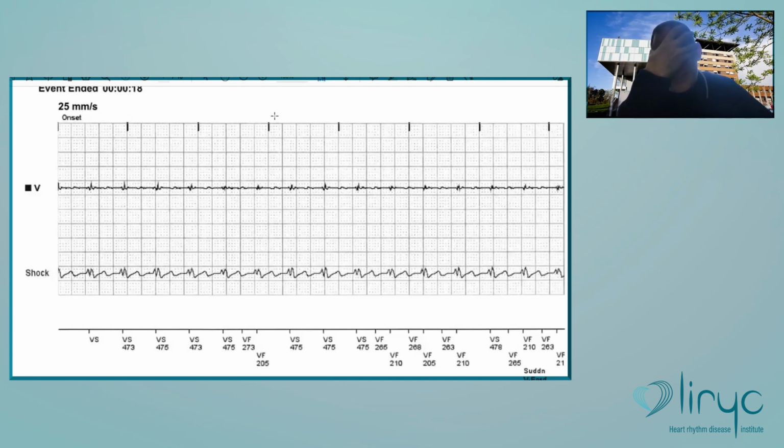It's surprising to see that you never see it with the Boston Scientific device. With MicroPort also, the rate of T-wave oversensing is very low. After pacing, with Medtronic and Abbott, you see too much of this. I think this should really be corrected. I don't understand why it has not been corrected yet.